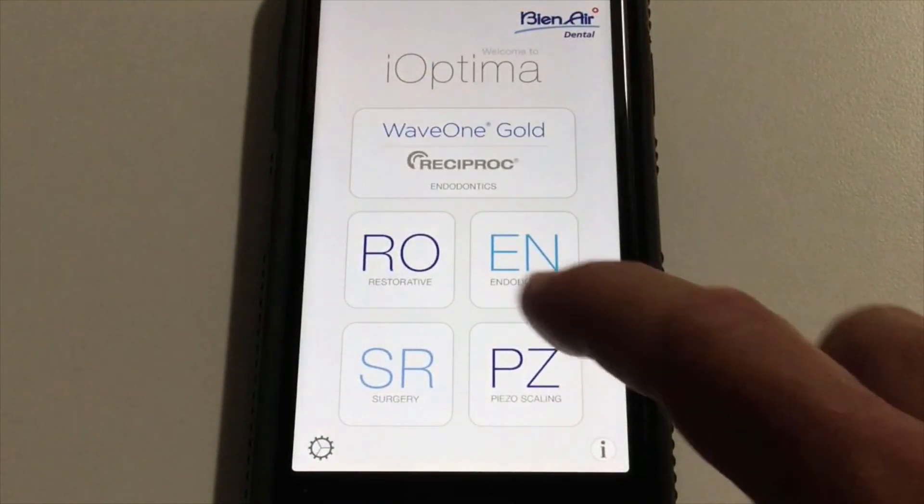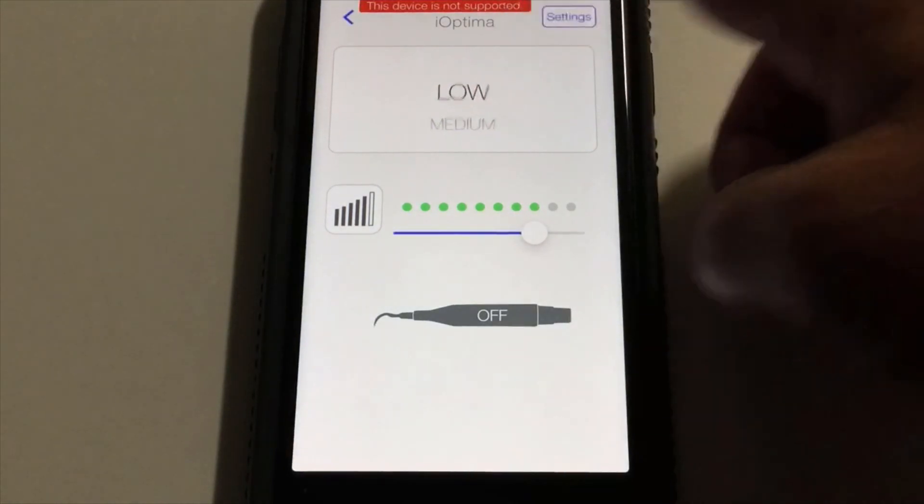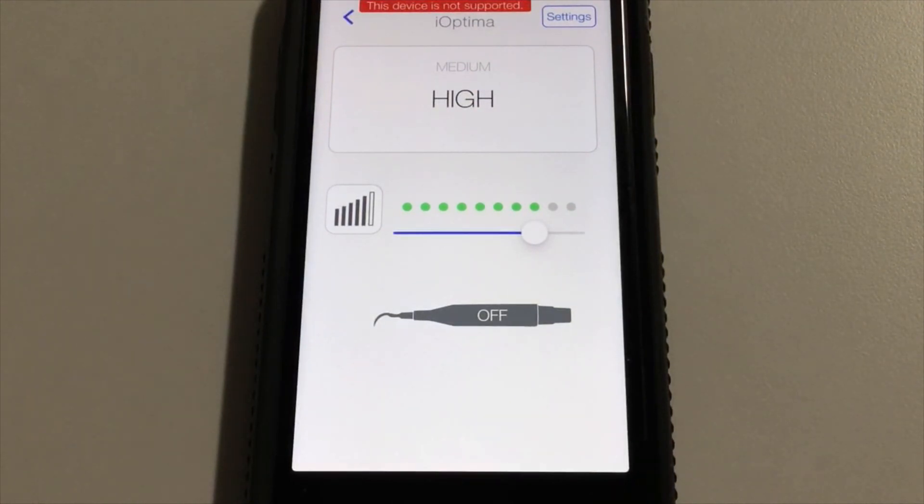Lastly, for those that want our system to operate and control a piezo ultrasonic scaler, we have that capability. You can have a low, medium, or high frequency setting pre-programmed in for your piezo. B&Aire partners with Metron and we provide and sell a fiber optic ultrasonic if that's your preference.